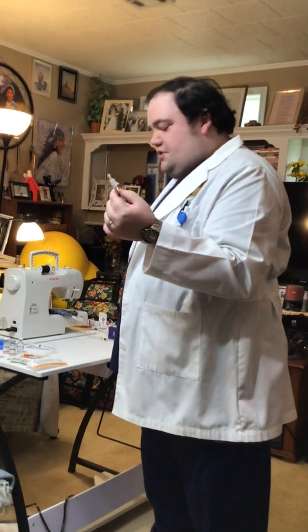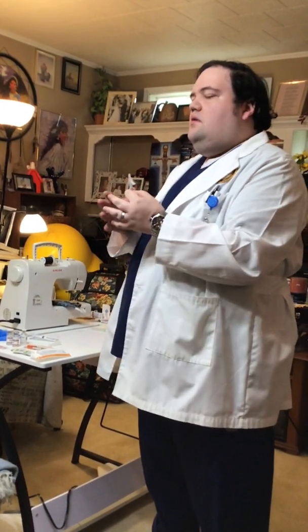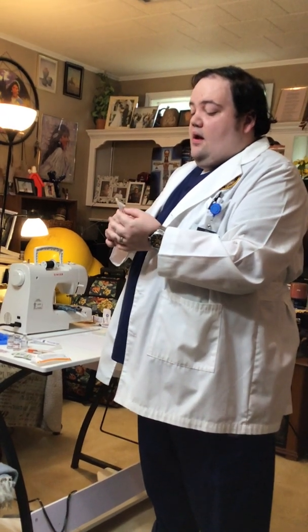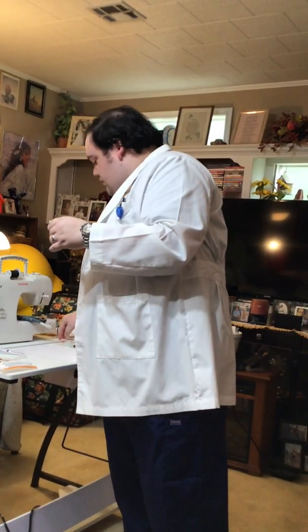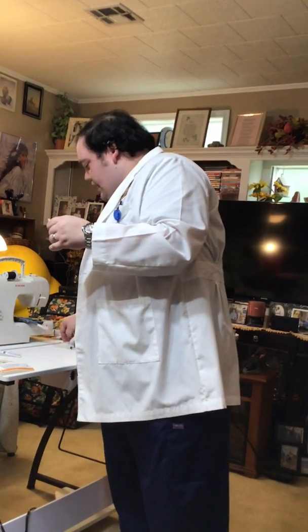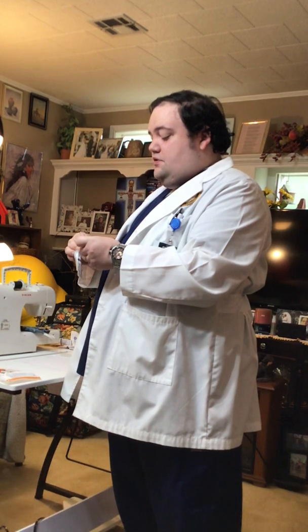An option would be to recap this needle with the scoop method, but we really want to avoid that option if we can, to avoid the possibility of needle stick. So in this case, we're going to activate the safety device, remove the needle, and put a fresh needle on. That will be used for the patient. Okay? I'm going to lock it on.